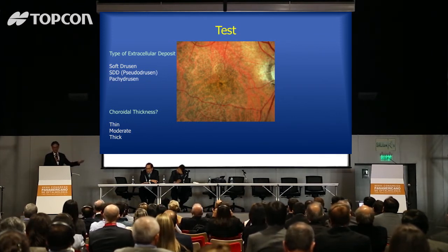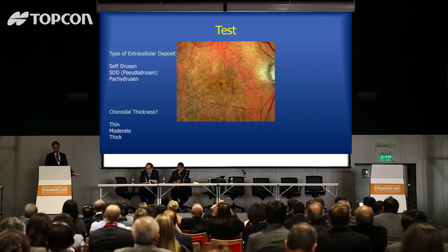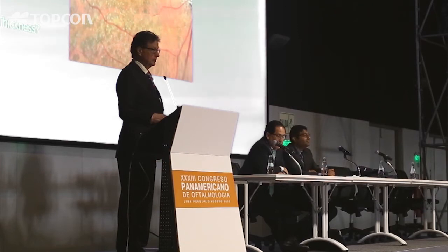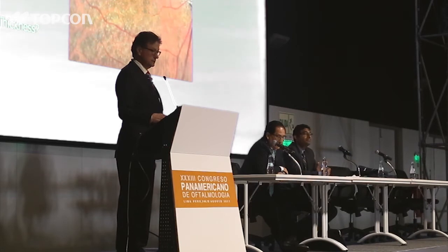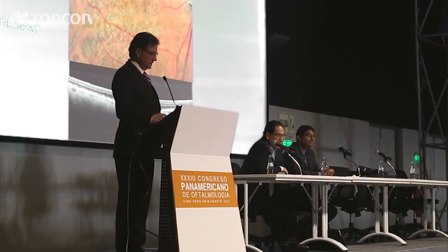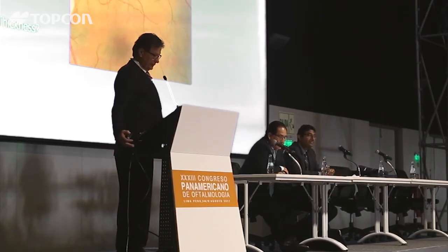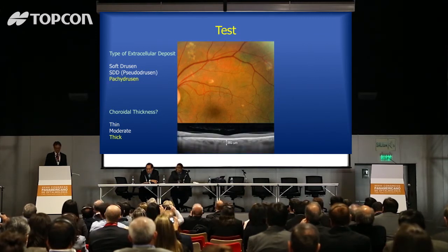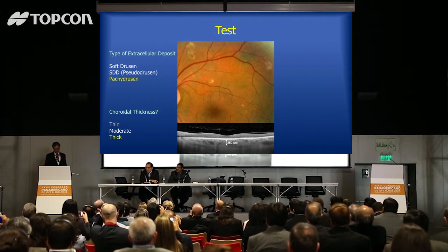What about this? These are small scattered dots with fairly uniform spacing between them. If you look at the choroid, it's easy to see large choroidal blood vessels. That's pseudodrusen, right? And the choroid is thin — 38 microns thick, with pseudodrusen. And the last one — bizarre-shaped drusen, you can't really see the choroidal blood vessels, reddish appearance, pigmentary changes between them. Those are pachydrusen, and the choroid is quite thick.